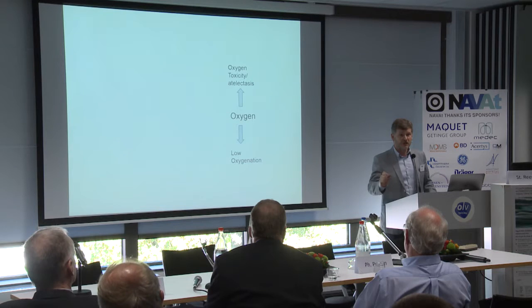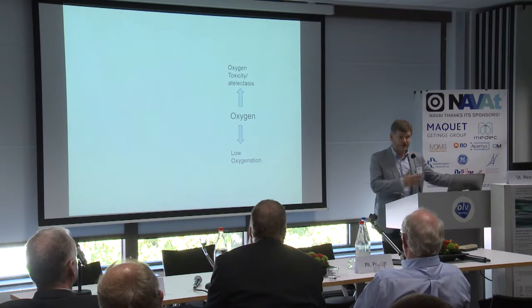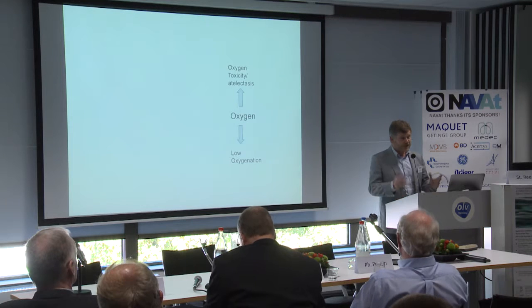And to answer the question of how much oxygen I would like, which was posed, I would like one to measure my oxygen consumption, to measure my hemoglobin level, and to calculate the inspired oxygen level that was necessary to fully saturate my hemoglobin to deliver sufficient oxygen to accommodate my oxygen consumption. That was what I would like. And if one can't do that calculation in the head, I'd like you to get a computer that can do it. So that's what I would like.